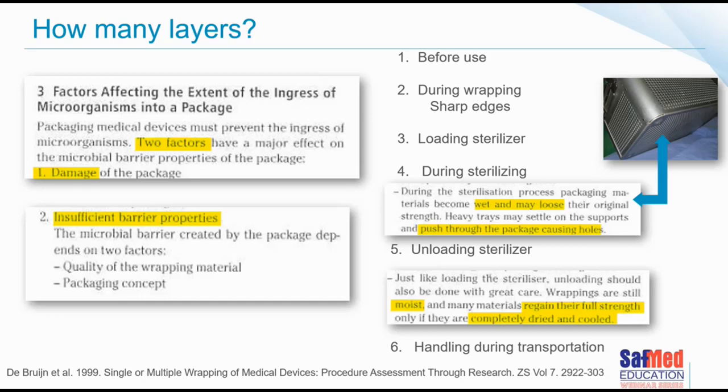That's why we would always suggest that an item being wrapped in a sterile barrier system, a sterilization wrap, has a flat base to the tray. Of course, the tray that's going to go inside of a container generally has some feet on it or some form of support, but when you're wrapping items that are going to be placed in a sterile barrier system of wrap, it really and truly needs to be a flat base. That makes good sense.